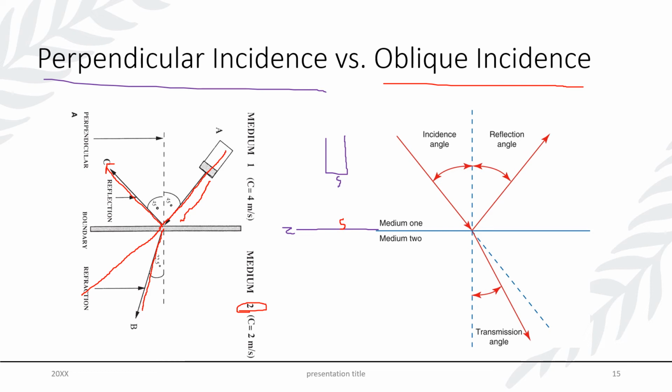If the propagation speed of media 2 is higher than that of medium 1, it would then have a greater angle than the 45 defined here because of propagation speed. Therefore, your reflections are going to be slightly out of alignment with where the anatomy really exists.